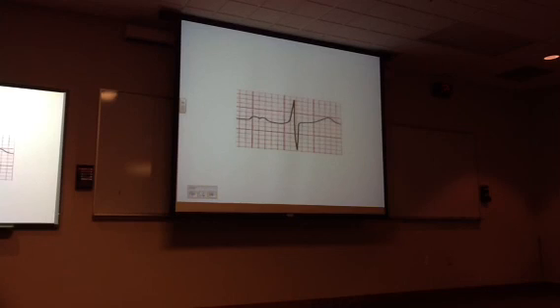All right. So what do we see here? This is just a cartoon.